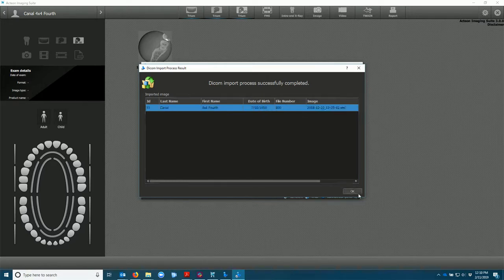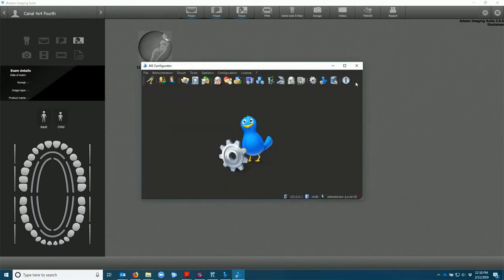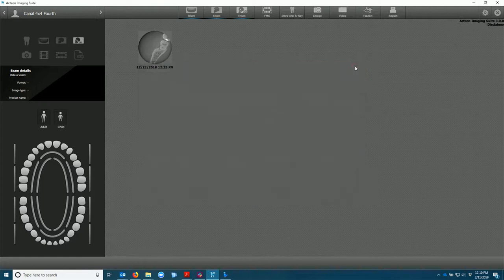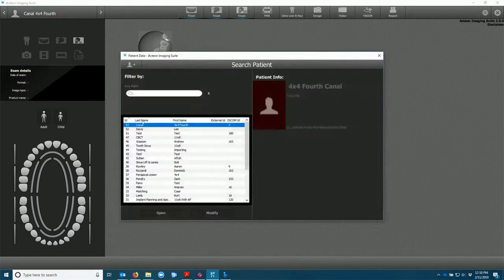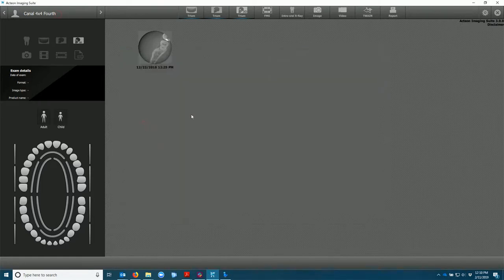Select OK. Close the window. When we go into that patient you'll see the scan there.